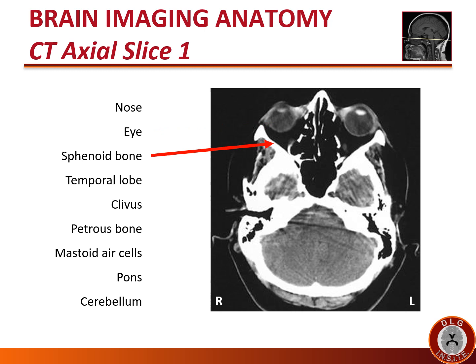The sphenoid bone is one of the bones that forms the orbit. Here, the inferior aspect of the temporal lobe is seen in the middle cranial fossa. The bony clivus is anterior to the brainstem. The word clivus means 'slide.' It sits at an angle in front of the brainstem, and the basilar artery courses rostrally between the brainstem and the clivus.